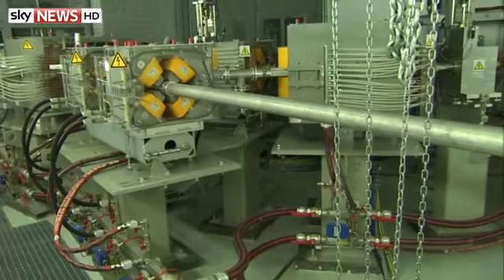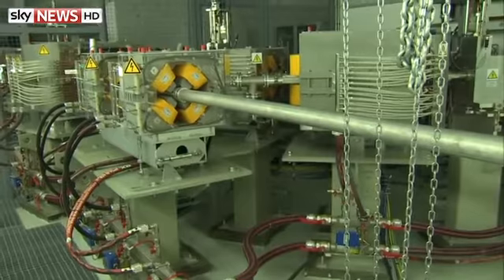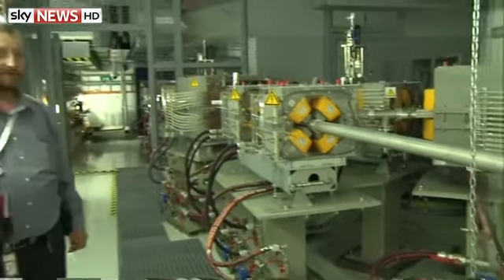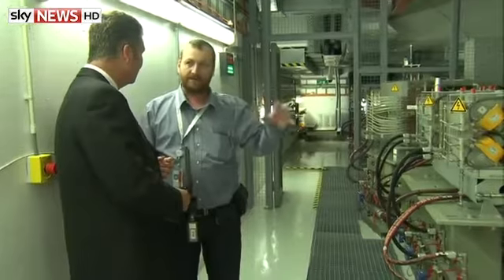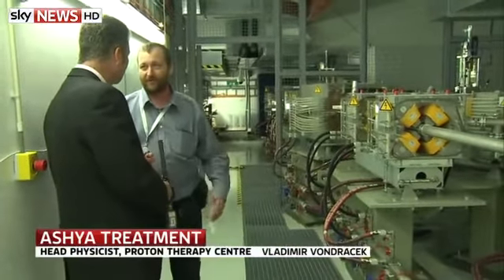And presumably eats electricity to keep it going. Yeah. You were saying to me earlier, I think it's the equivalent of something like 2,000 domestic refrigerators. Like that, it depends on what kind of refrigerator you have. The power consumption of the whole line is roughly 400 kilowatts, which you can transform to a number of refrigerators. It depends on the consumption of your refrigerator.